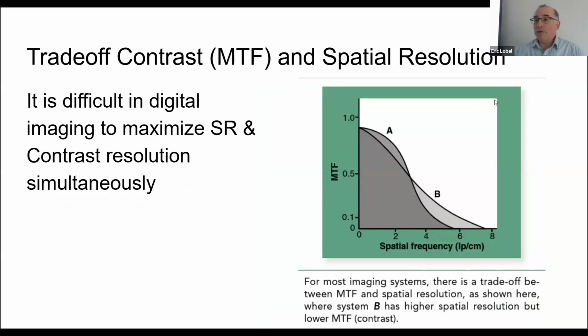Okay, so what is our trade-off? So this is the trade-off, right? It's kind of difficult to maximize spatial resolution and contrast resolution simultaneously. I said that earlier, usually when one goes up, the other goes down.